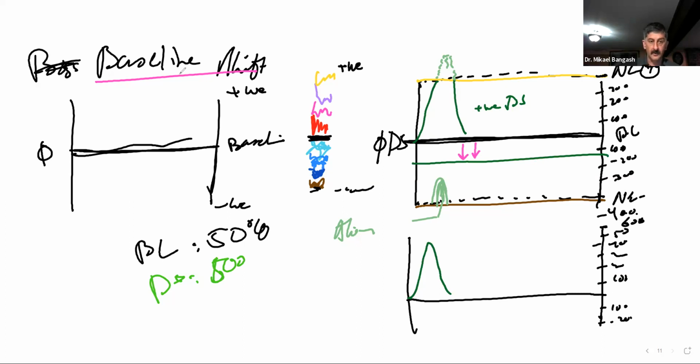So just by moving the baseline down, or in this case doing a baseline shift, the total scale limits still remain the same. It was still able to measure only 400 on the negative side and 400 on the positive side, a total of 800 centimeters per second.